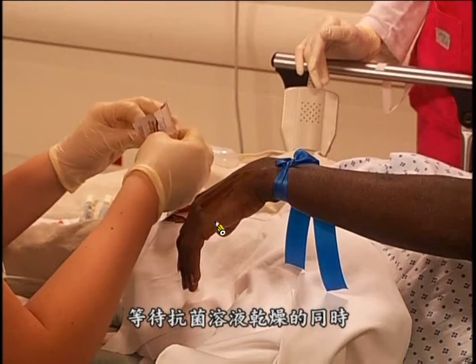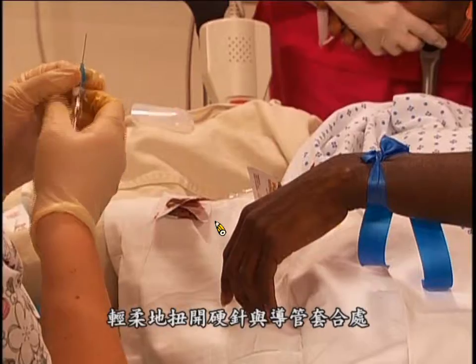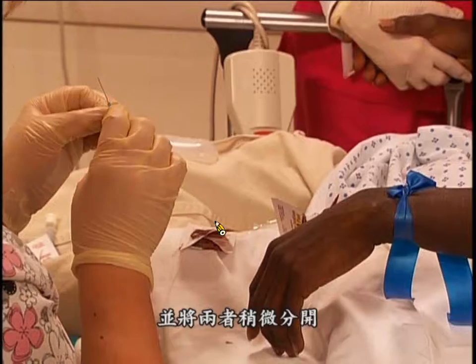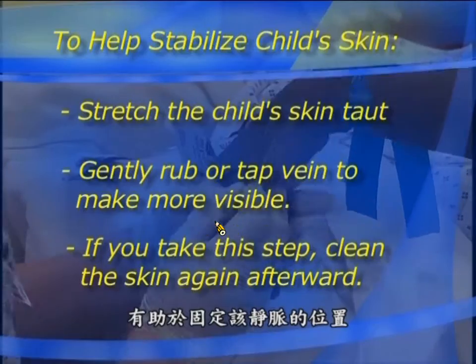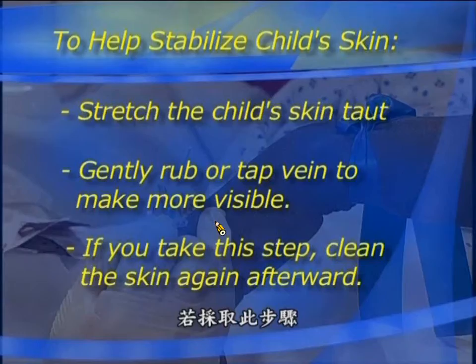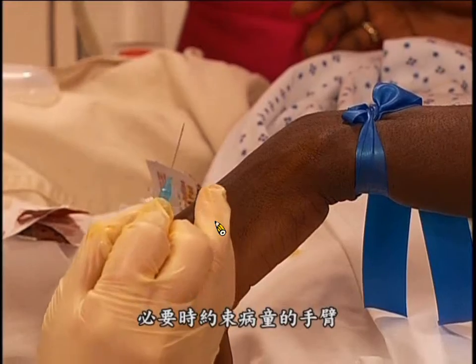While allowing the child's skin to dry, inspect the catheter to check for damage. Break the seal between the stylet and catheter by gently twisting and separating them slightly. Then stretch the child's skin taut to help stabilize it, and gently rub or tap the vein to make it more visible. If you take this step, clean the skin again afterward. If needed, restrain the child's arm.